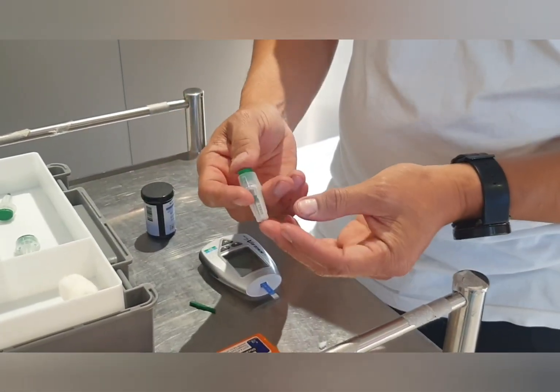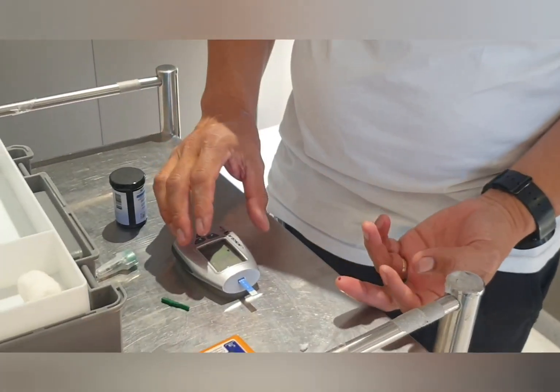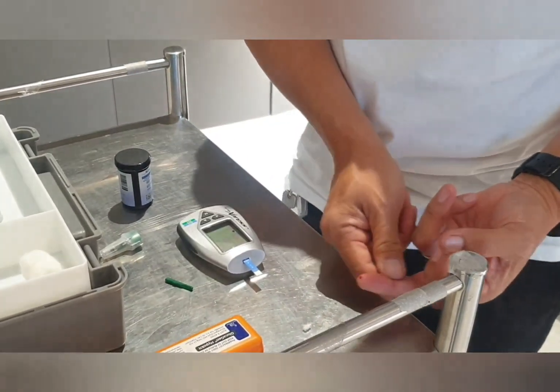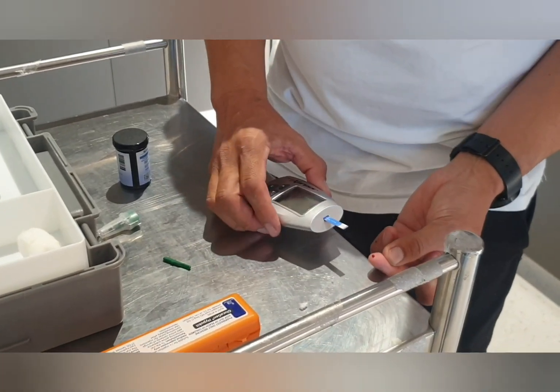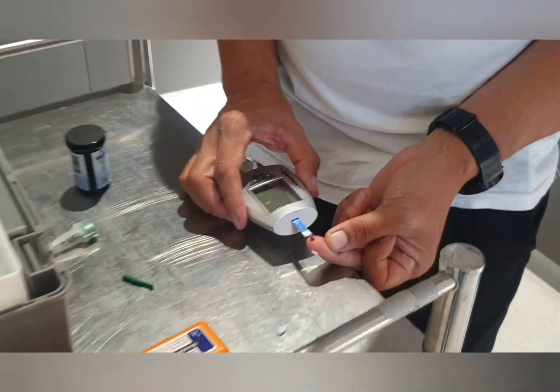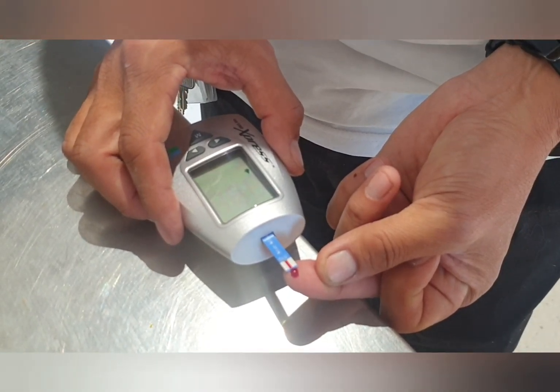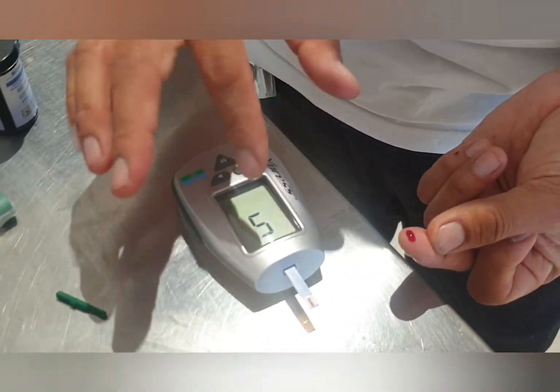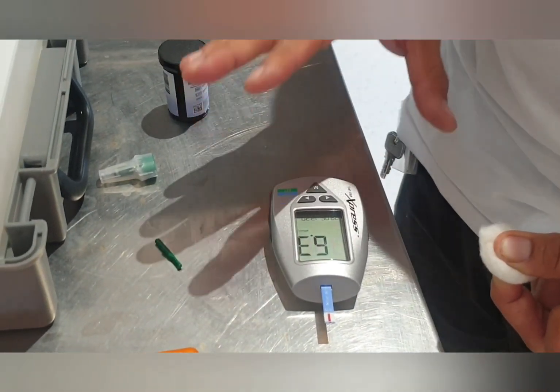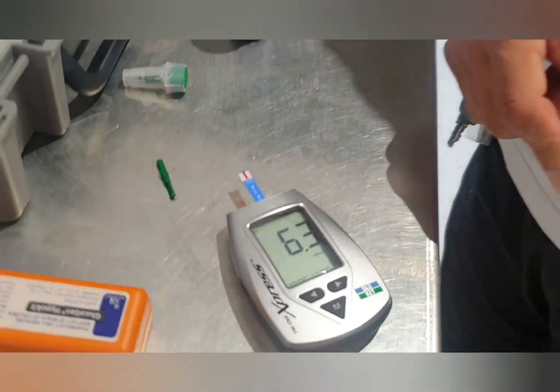There's a little lancet device — just twist it, put it over your finger, stab it, and get the blood out. It's always easier to take the machine to the patient. A lot of people get this wrong and take the patient to the machine instead. Get the patient to keep nice and still, then slide the strip onto the patient's skin so that it will absorb the blood. Once it has enough blood, you'll hear a beep confirming the test is running. This is giving me a glucose reading of 6.3.